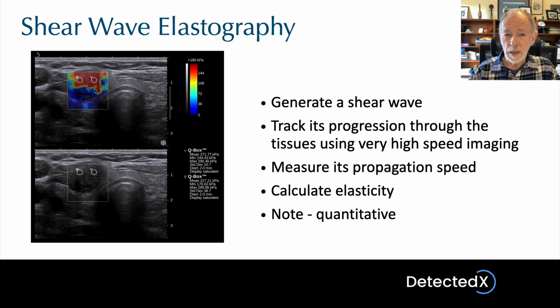There's another technique entirely that's also used to do elastography. I should explain, by the way, that the concept for elastography came about from the observation that manual palpation is a very, very useful clinical tool. Clinicians can acquire lots of useful information simply by palpating tissues, looking for abnormal stiffness. So the idea with ultrasound elastography is to extend this to deeper tissues that aren't readily available for manual palpation.